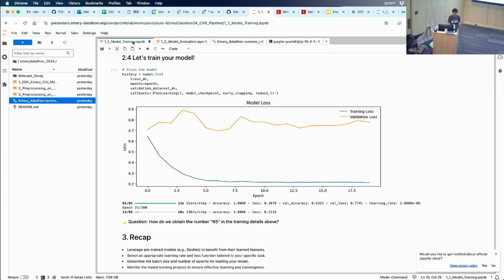But you have to say, you never have enough images. Sorry for the repetition, but you never have enough images in medical imaging. So you'll always require some form of pre-training. That means you have to load the model, ResNet or whatever model you want. The best way to figure out what that model is, is to look at the literature. And for chest X-ray, it tends to be DenseNet 121. So you load that model, but you now have to provide your 1,000 chest X-rays or 1,000 mammograms to the model for it to learn the fine things about medical imaging.